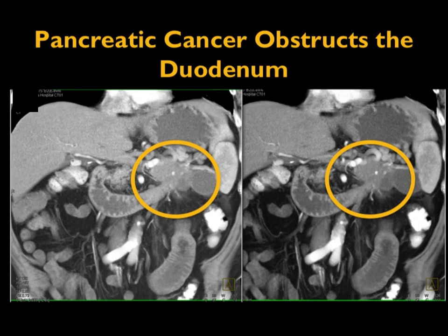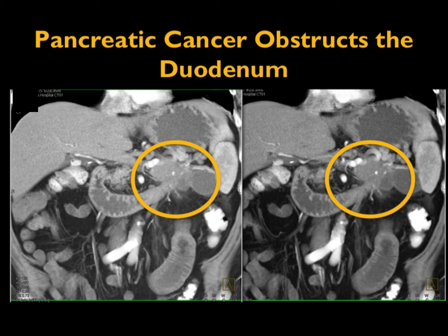When you're looking at obstruction, you can often see the cause. In this case of suspected bowel obstruction, you can see a mass in the tail of the pancreas that was not previously known. This patient's small bowel obstruction and gastric outlet obstruction — the presumed diagnosis — is actually due to a carcinoma of the tail of the pancreas obstructing the small bowel at the ligament of Treitz. A very nice example.